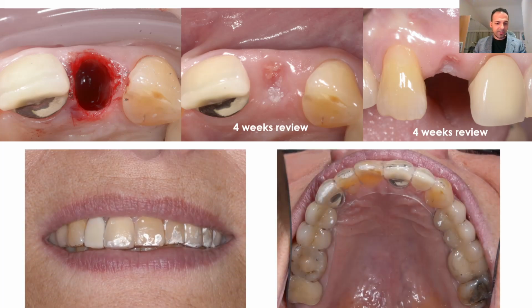Let's take it further. So what do we do in this situation? This patient actually had a retainer with the pontics placed there. You can see there's a bit of a color mismatch. The patient was planning on whitening their teeth, and so that's why we went for this whiter color, which actually matches her crown bridges on the upper right region. And yeah, so upper right 2, you can see the design of the retainer positioned here palatally, and really it just looks like the patient's got Invisalign in their mouth, and from a distance it's not noticeable. It's only obvious close up with a DSLR that you're going to see it this well.